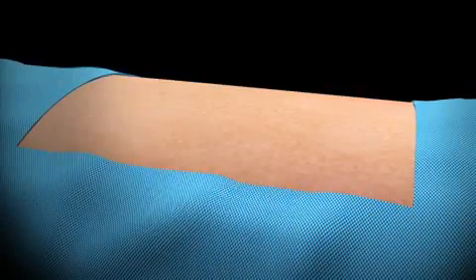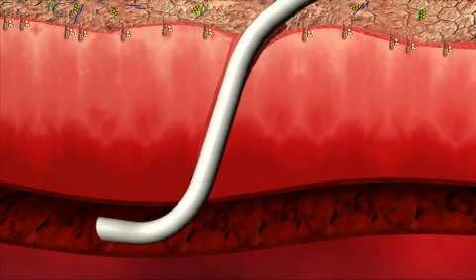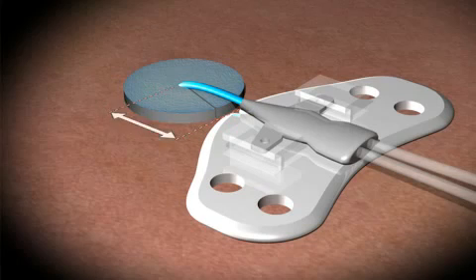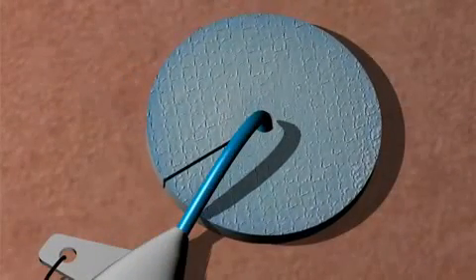Maximum sterile barrier precautions prevent cross-contamination of transient organisms and protect the skin preparation. Insert catheter into prepared skin area. When fixing the catheter in place with a suture or a sutureless securement device such as StatLock, leave enough room for BIOPATCH to lie completely flat against the skin. Failure to leave enough room will prohibit the BIOPATCH disc from 360-degree protective coverage.